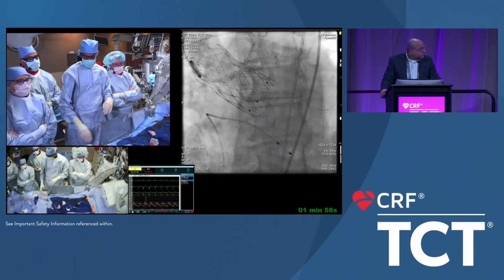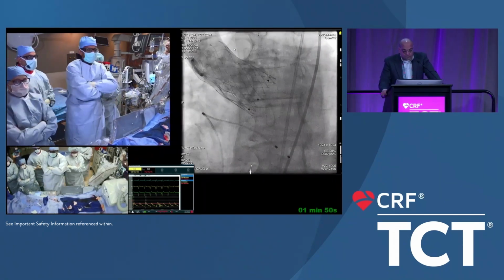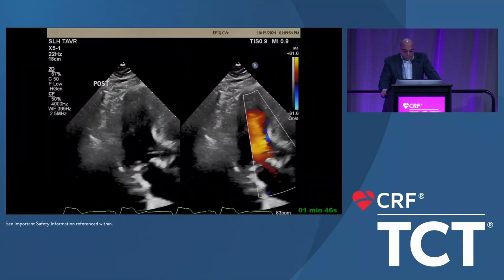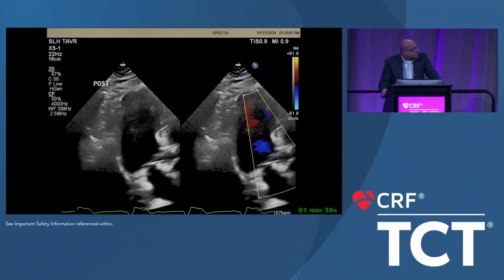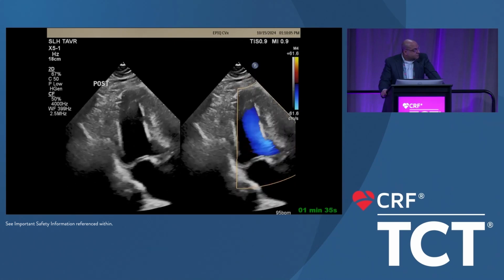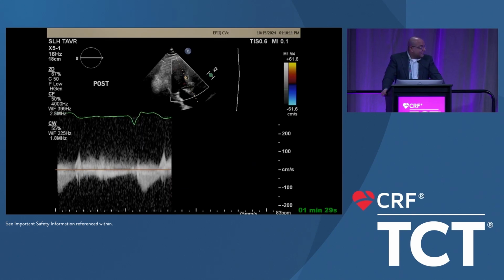So what do you get? So what do we do with this? So, we argued about this. There is PVL here. Is it mild? It's less than mild. Can't see it on echo. At 1,000 psi, I would leave that alone. Absolutely. All right. Well, yesterday I said 900. Sushil said 1018. I was like, okay, then I'll say 1,000 psi today. But there's no PVL. I'll leave it alone.